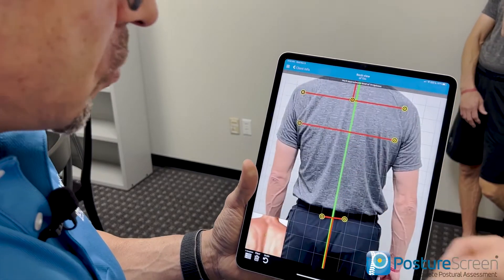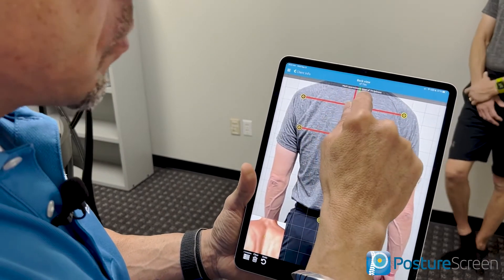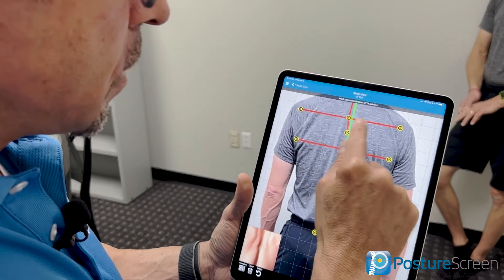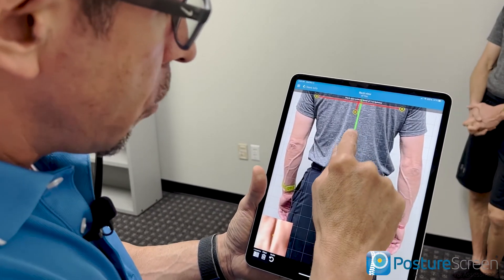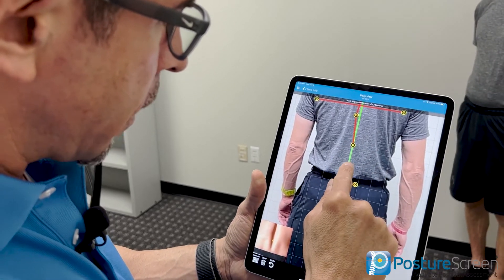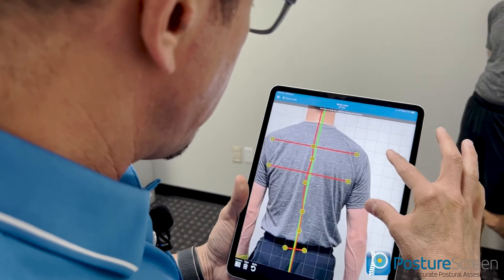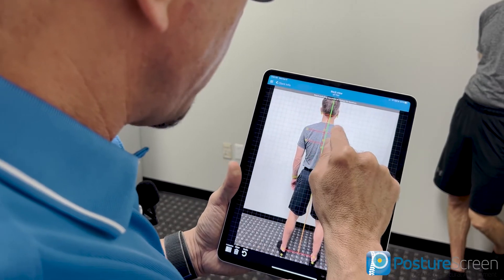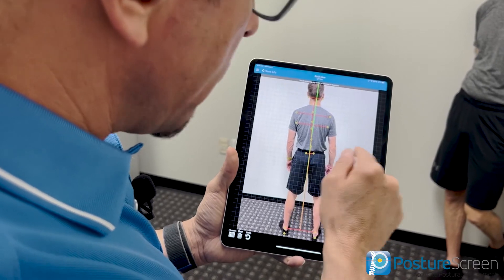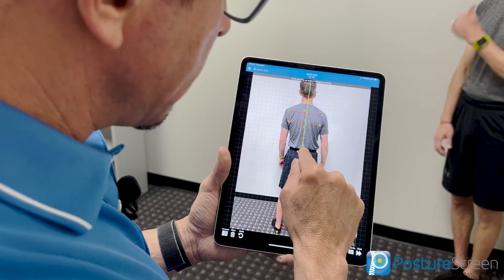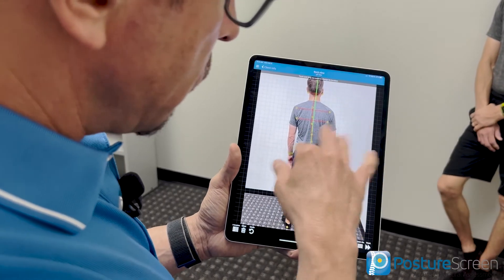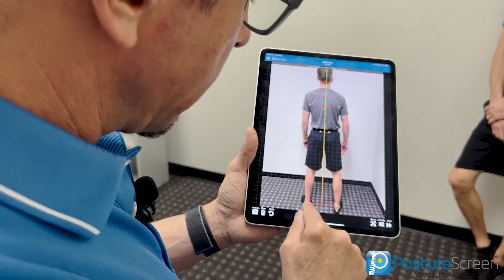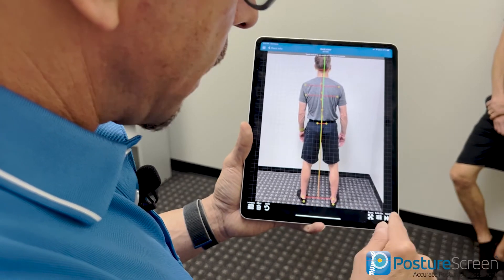On the posterior view it tells you exactly what to click. Mark the ear margins. Then it asks for the approximate level of T4 spinous — I find it easier to place the points where I think they are, then magnify and refine. With the shirt off you can approximate those points more accurately. The PSIS is estimated along the belt line. Then double-check the markers for pronation/supination, and that's it.